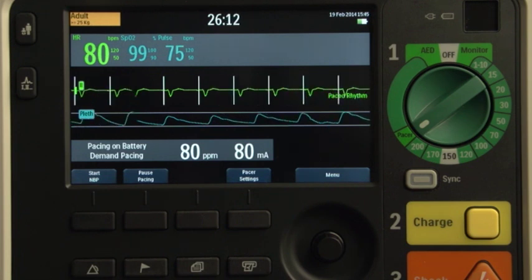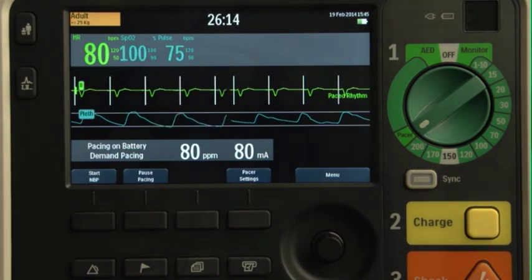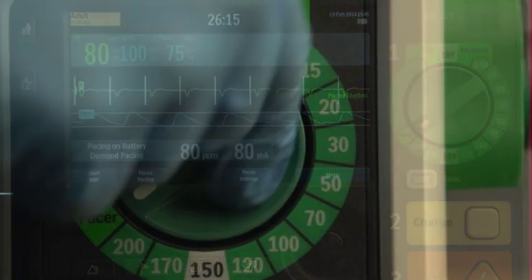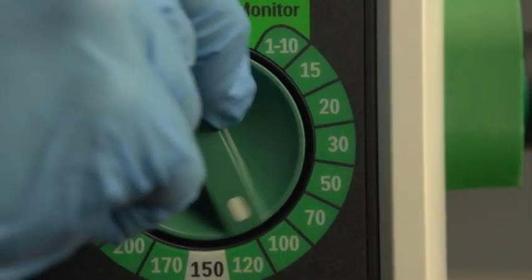When pacing is no longer needed, turn the therapy knob from pacer to monitor.